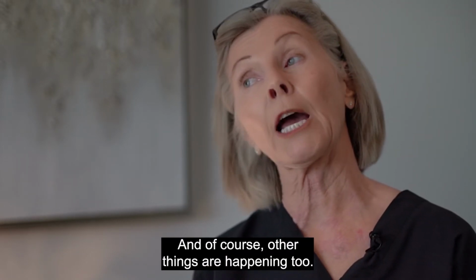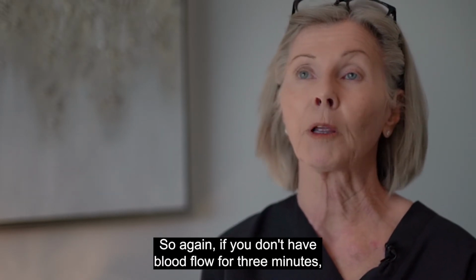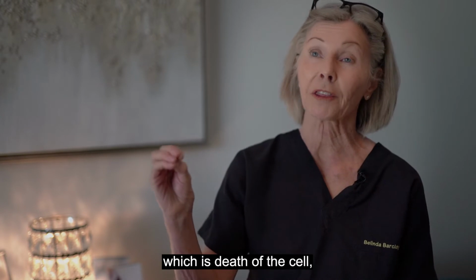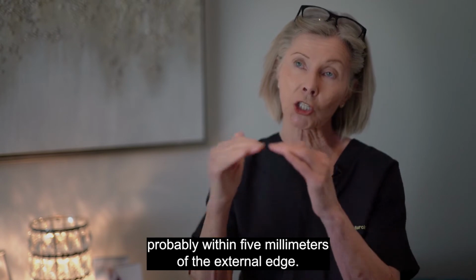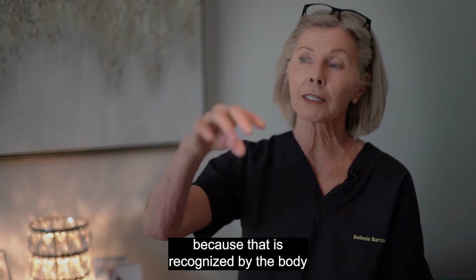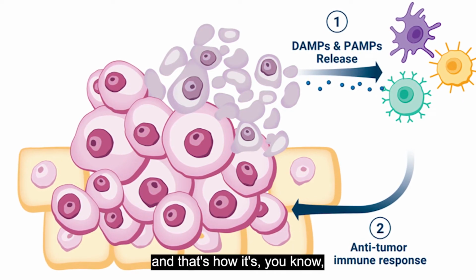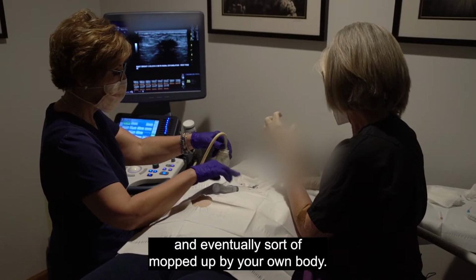And of course other things are happening too. You're interrupting the blood flow, so again, if you don't have blood flow for 3 minutes, you're effectively killing the tumor too, even without the cold. There's something called delayed apoptosis, which is death of the cell, which will happen probably within 5 millimeters of the external edge. So you get an even extra effect there. And that's all good, because that is recognized by the body, and you get the inflammatory reaction, and that dead tissue is recognized and eventually mopped up by your own body.